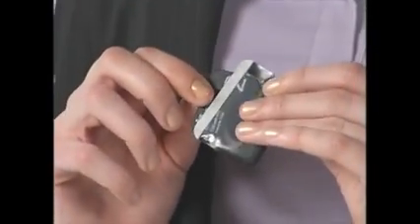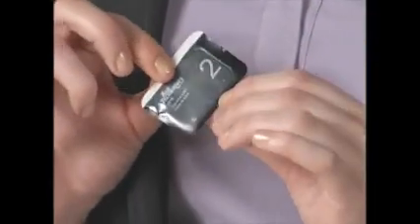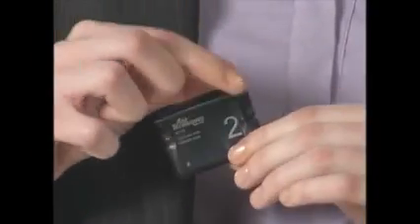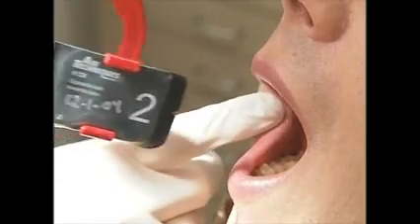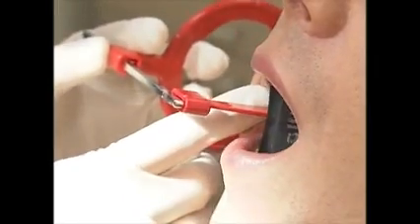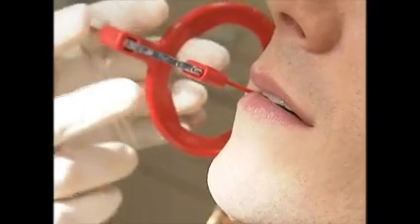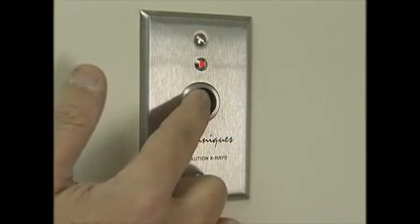So far we've taken an erased phosphor plate and inserted it with the printed side facing out, through the window in the barrier envelope. We've sealed the envelope by peeling off the adhesive strip, and we've put the envelope into the patient's mouth, with the opaque side facing the tube head, and the printed side of the plate visible. The opaque side always faces the tube head. The little letter A is our reference that the plate is inserted correctly. Now expose your images.